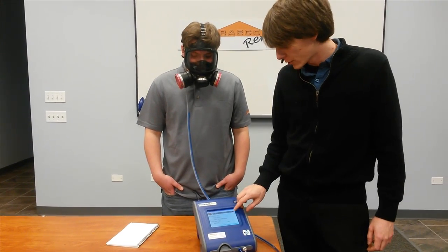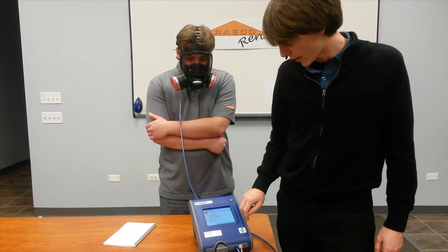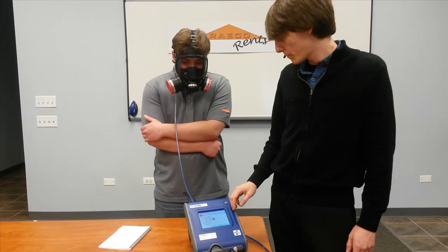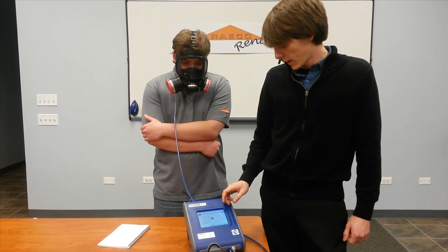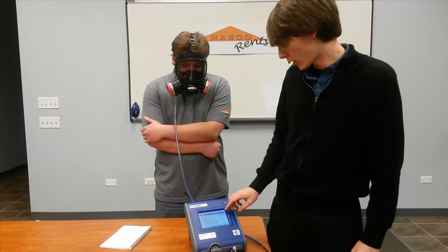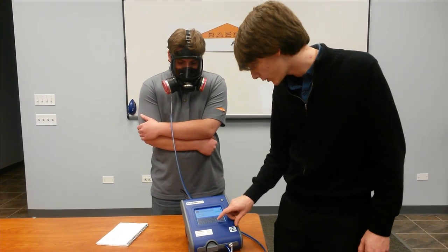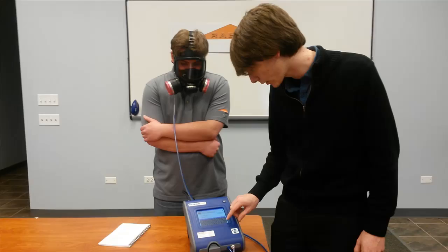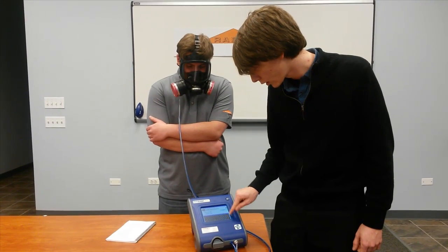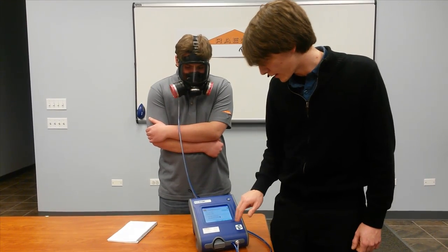The port account will prompt you to select a respirator. Pick the respirator that they're wearing and touch the next button. The last thing the port account is going to have you select is the protocol that you're going to test with. Most people are going to use OSHA. You'll need to enter the mask size — which is a medium for us — and the operator. I'm going to put my initials.